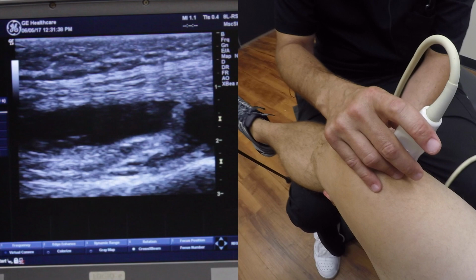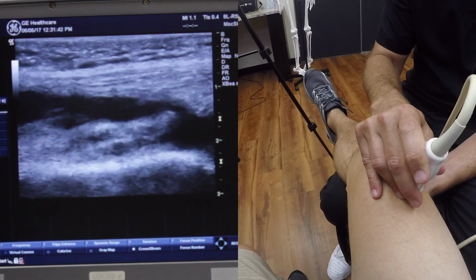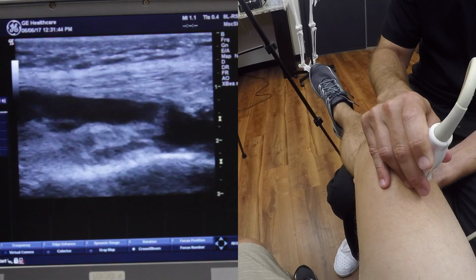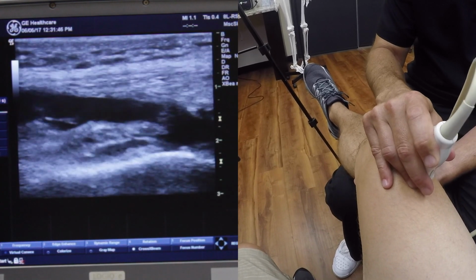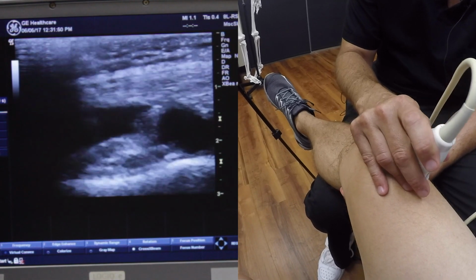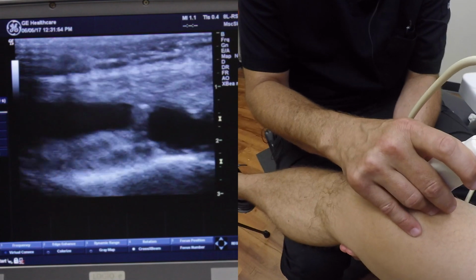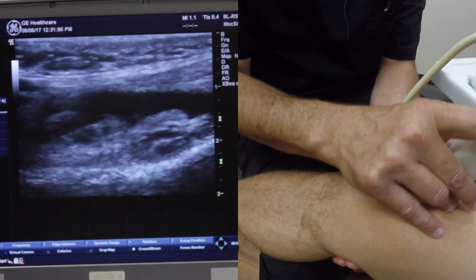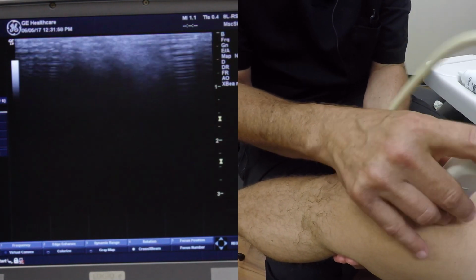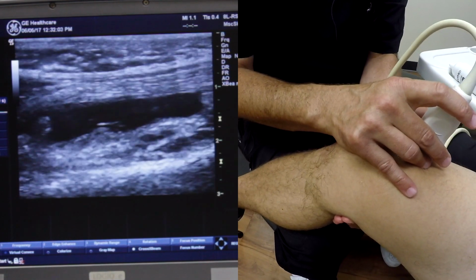And you can see when I move it around, you could see that tissue, which is some synovial tissue, flapping in the breeze there, flapping within the fluid. It almost looks like some kelp in the ocean or some seaweed. But this is definitely an aspiratable knee. But in an interesting way, there are no symptoms here.